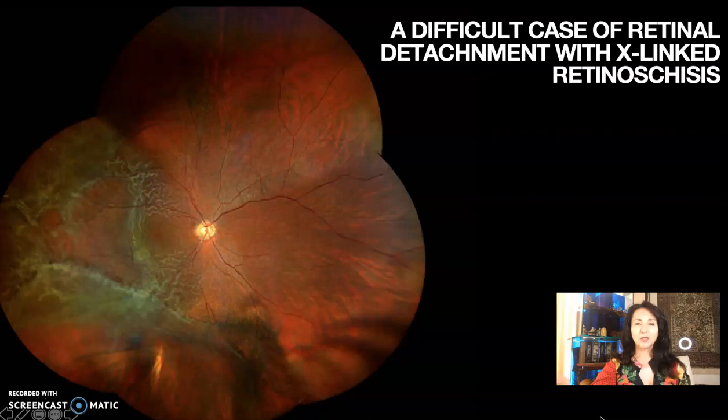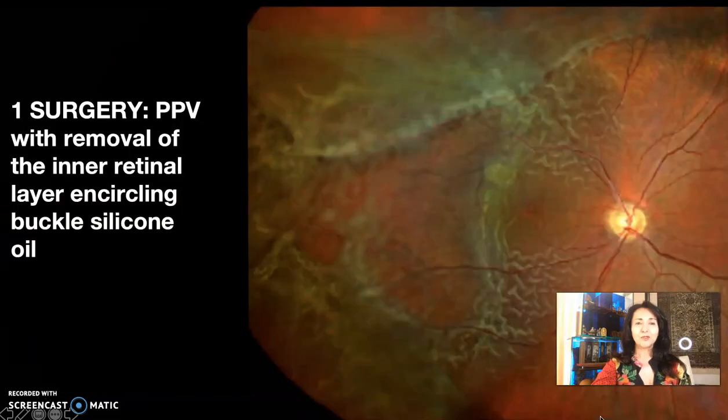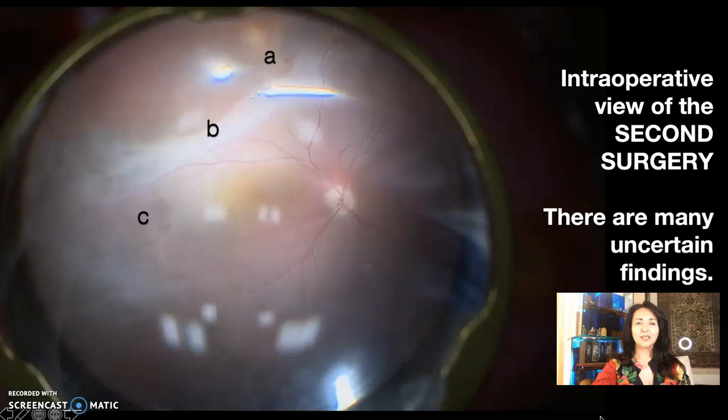Look at this difficult case of retinal detachment associated with the X-linked retinoschisis. The first surgery was vitrectomy, buckle, removal of the inner layer of the retina, and silicone oil. And this is the intraoperative view of the second surgery for a relapse of detachment. There are many uncertain findings.